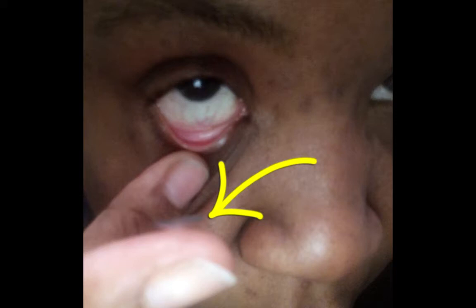You have to open your eye up as big as you can. Then I hold my contact on my index finger and wet it a little bit. It's better when it's wet because it kind of sticks to your finger and you're not as liable to drop the contact.